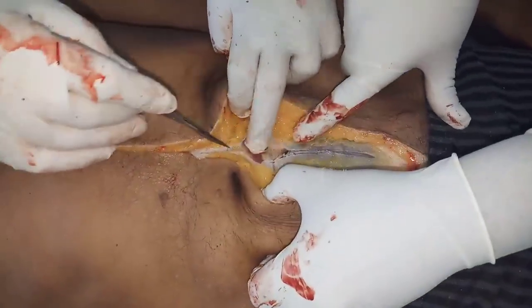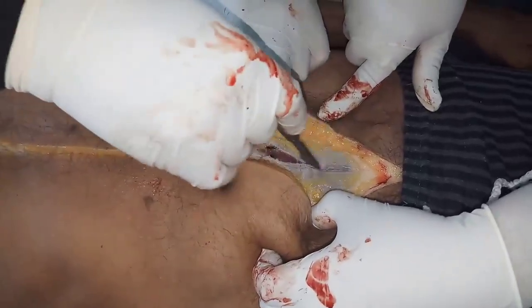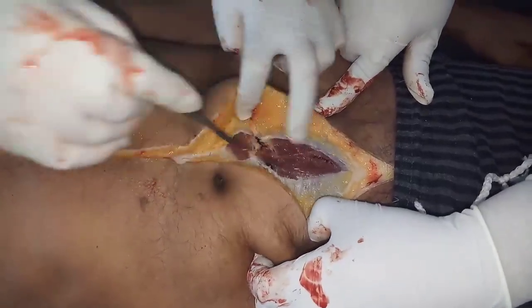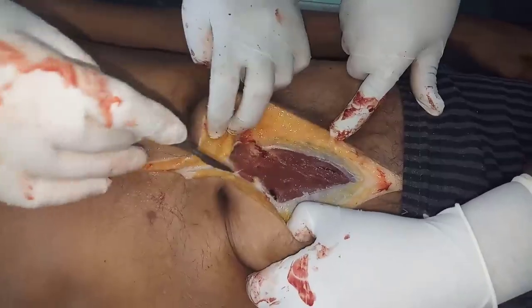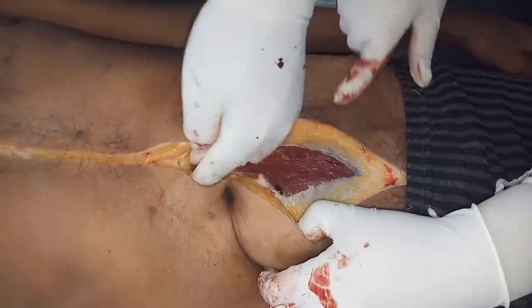See, now these muscles are there. You can see the muscles. We will cut these muscles also. See, we are cutting the muscles also. And finally we will reach the peritoneum. I have reached the peritoneum here.